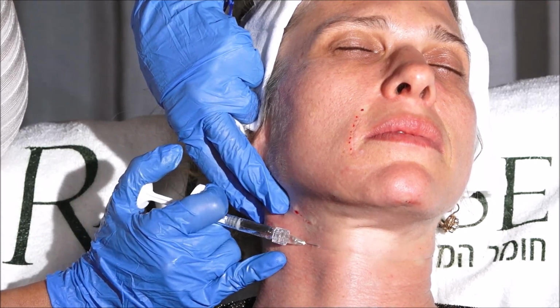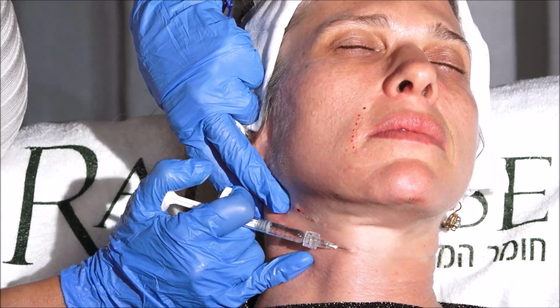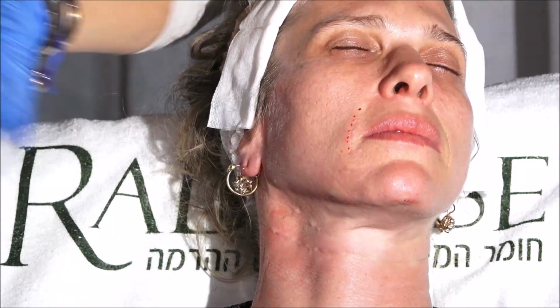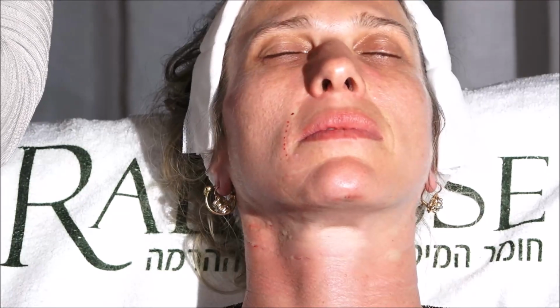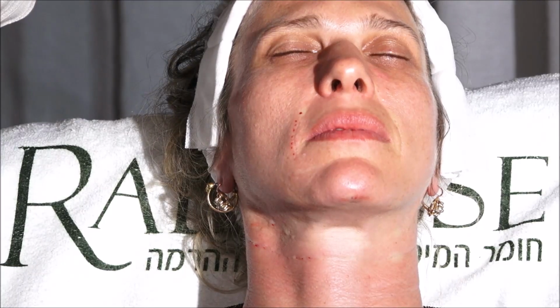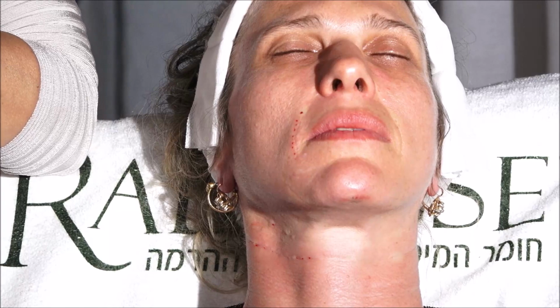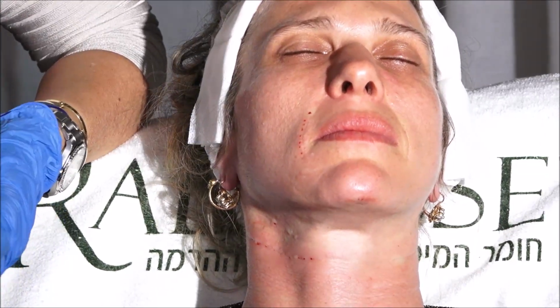I normally go along the line and across the vessels. Actually, with Soft, it doesn't make any difference because the spread of Soft is round towards the needle, different than Balance and Intense. So if I do like this, Balance goes like this, and Soft goes round. It doesn't matter. So if I'm doing Balance, I'm going across the wrinkle. If I'm doing Soft, it doesn't matter.